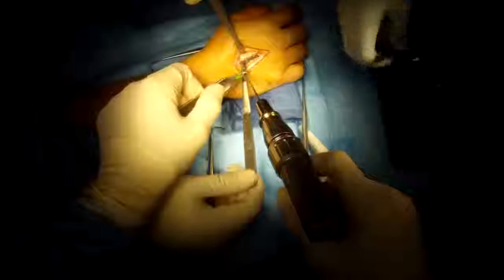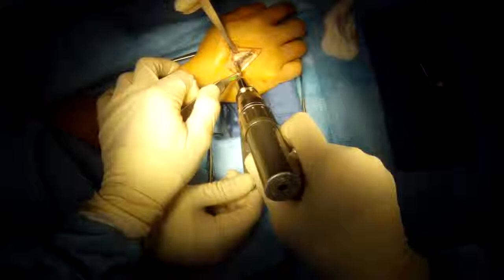Remove the wire. I'm going to place a total of four screws into this bone. It's a very strong fixation.